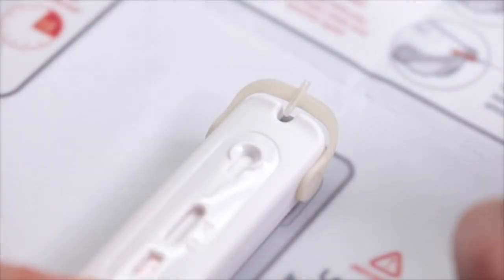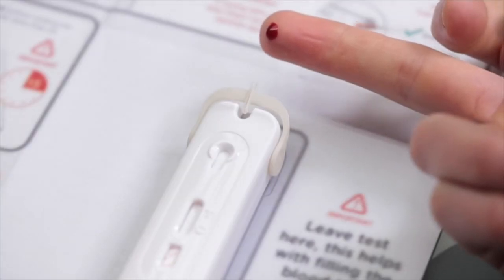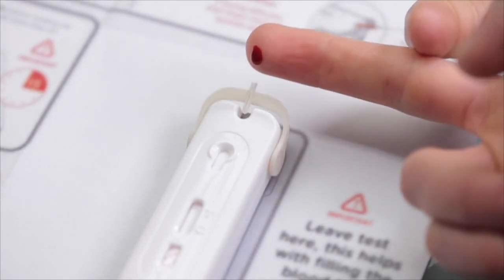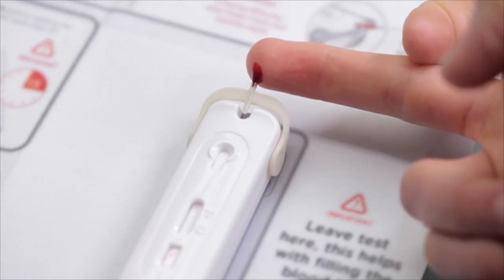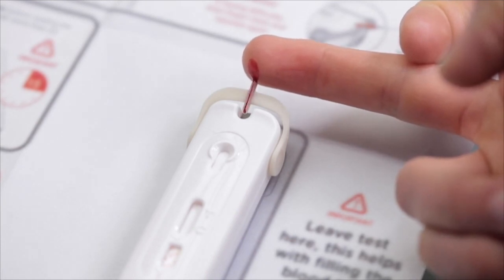The most important thing to remember from this video is that when you are filling the blood tube, keep the device on the table the entire time. Hold your finger in a downward position, gently touch the blood to the tip of the tube and avoid touching the tube with your skin.